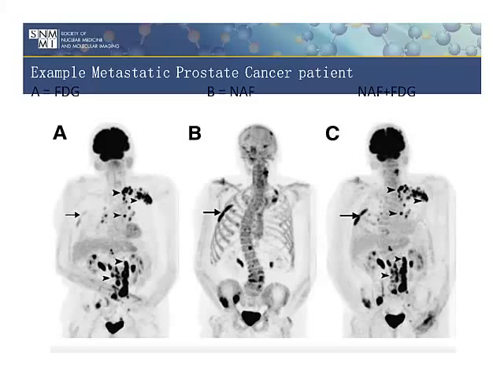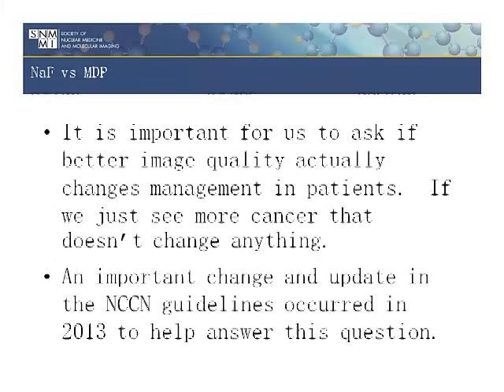So then you go back and look at the hips: activity, activity, activity, no activity, activity, no activity. Activity in FDG, no activity in sodium fluoride. So in order to get a complete picture, we just add them together. We have a simple software package. The doctors want to know every cancer they can see, and then we just add them together. Simple. This is easy in prostate cancer. When you get to breast cancer, you have a whole other problem. We'll get to that in a minute.